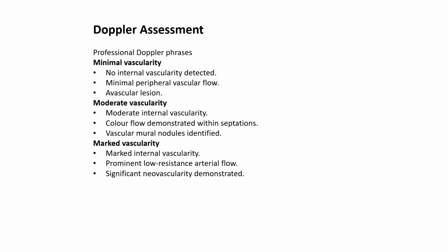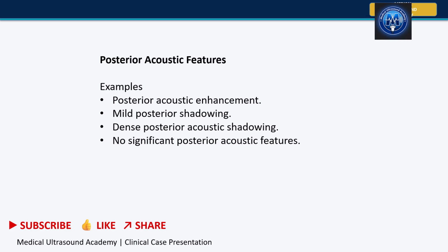Doppler assessment. Professional Doppler phrases: minimal vascularity, no internal vascularity detected, minimal peripheral vascular flow, avascular lesion, moderate vascularity, moderate internal vascularity, color flow demonstrated within septations, vascular mural nodules identified, marked vascularity, marked internal vascularity, prominent low resistance arterial flow, significant neovascularity demonstrated. Posterior acoustic features.